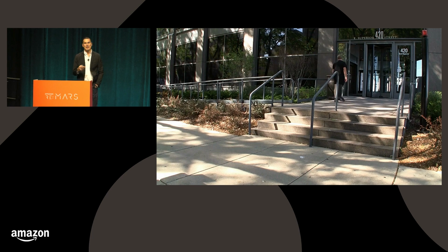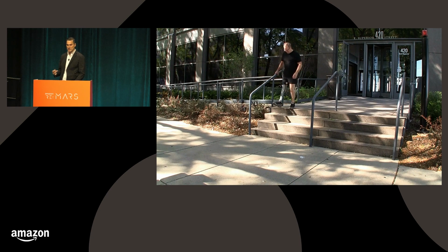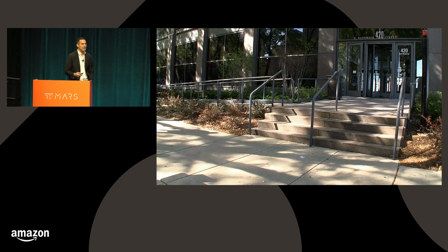His prosthesis is mechanically passive. So that means it can only dissipate energy or store and return energy, but it can't add any net positive mechanical energy, like what happens in the able-bodied limb when we flex our muscles. We add energy. So this makes certain activities very difficult, like going upstairs, or going up ramps, or carrying a heavy object, or walking over uneven terrain. Passive systems just cannot provide the necessary energy, and it makes him have to use his contralateral limb more. It can be more exhausting.